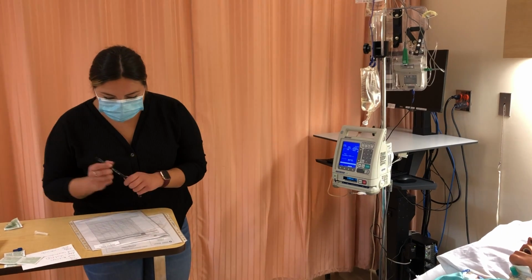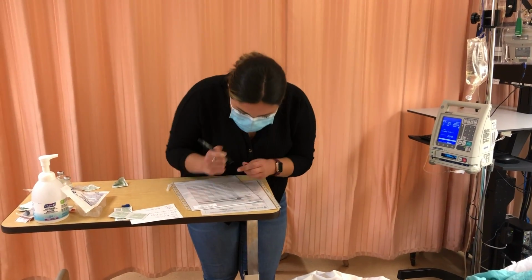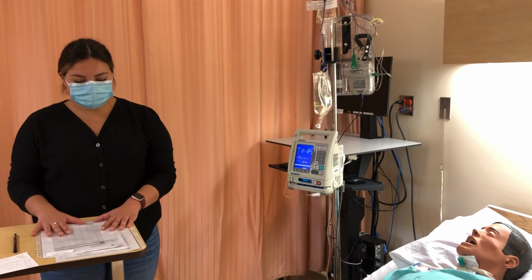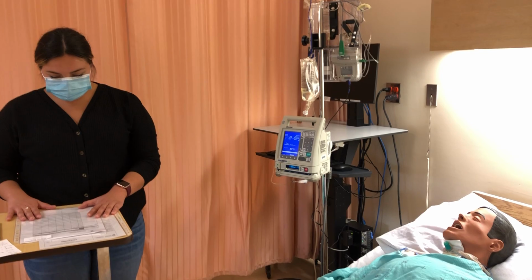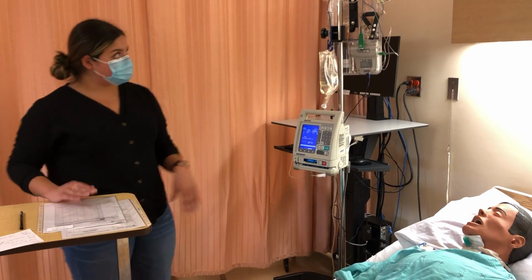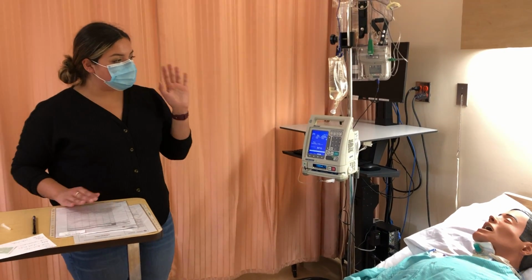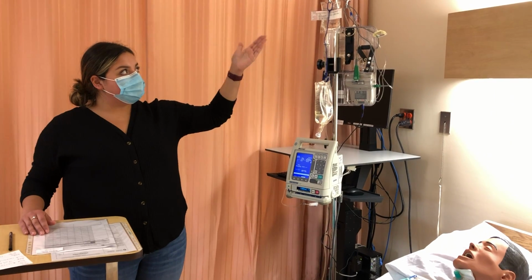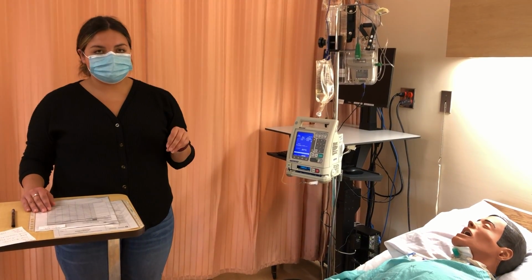So I'm going to sign off on my MAR. So I have KSUMSN3 that I've given this medication. I'm also going to fill out the fluid balance record to say that I have administered fluids to this patient. MAR, fluid balance record. Everything is running fine. So I'm going to return in 30 minutes to ensure that my secondary bag has fully infused and to administer a 15 cc flush to ensure my patient has received all of the antibiotics she has ordered.